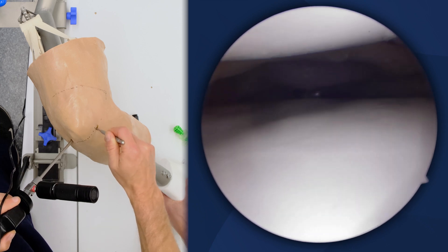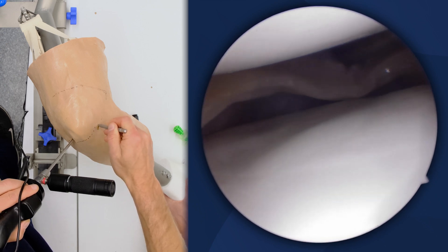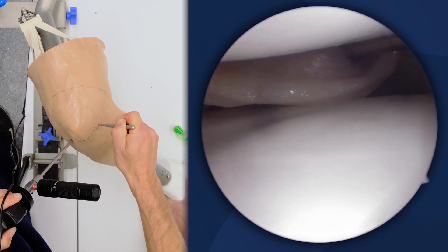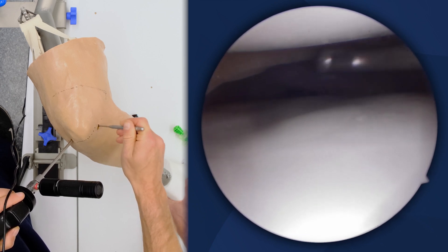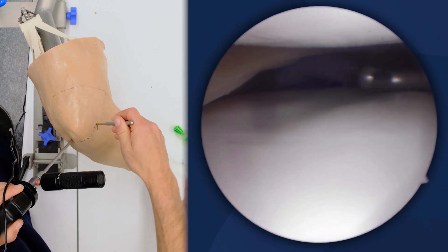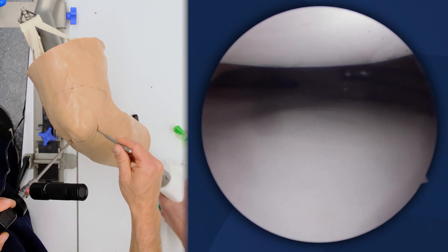You can see that capsule in the back and some of that fat pad. I'm trying to get the probe to see if I can get it in the hiatus. Teaching residents to probe this meniscus and see its mobility — this is a pretty stable lateral meniscus. It's not tracking beyond the 50 percent zone of this compartment and is not showing a drive-through sign. This would be an appropriately normative, probably average, lateral compartment gapping in this figure four position.